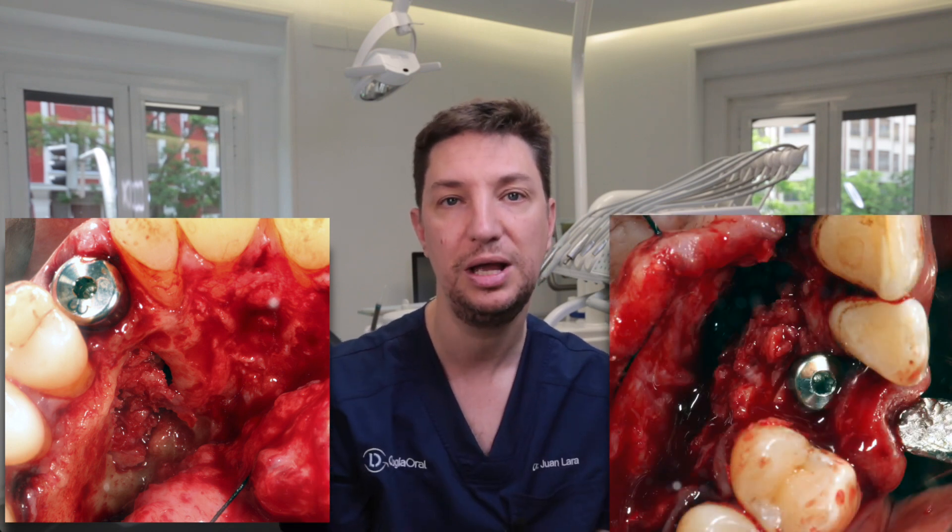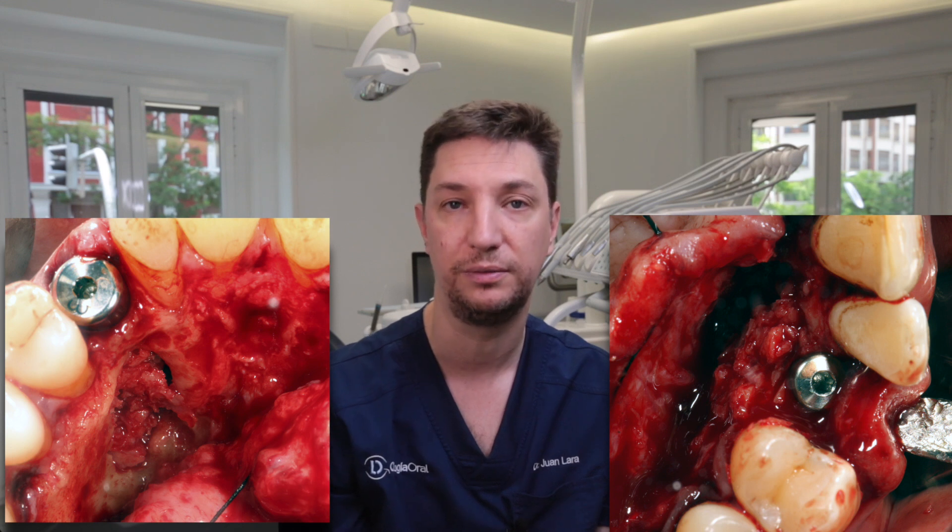Now that the implant is placed, we take all the bone we scraped earlier and place it in the defect. We do not need to place any membrane, because the palatal tissue has no muscle — it stays attached to the bone and keeps our graft immobile. Then we wait approximately 3–4 months for the osseointegration period. Once that's done, we can check if we need some tissue augmentation on the buccal side, or if it's not necessary, and send the patient to the prosthodontic colleague to perform the crown. One surgery: remove the impacted canine, place the implant, graft — and everything is done.